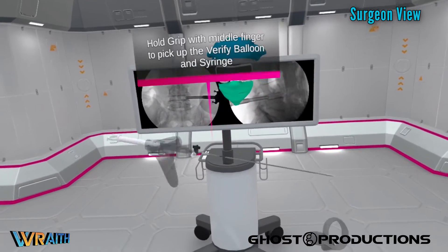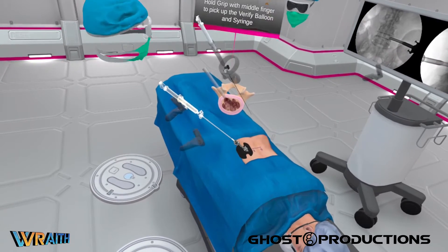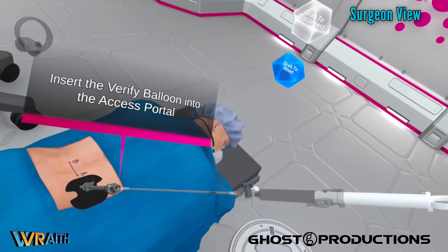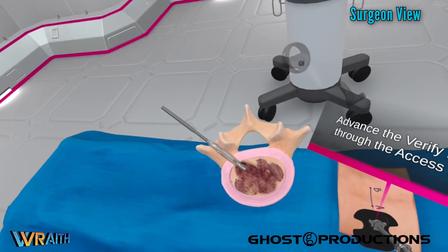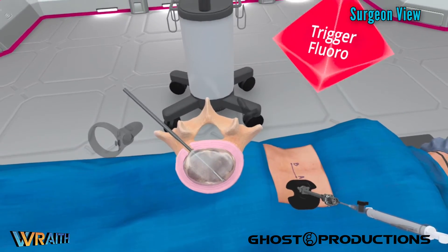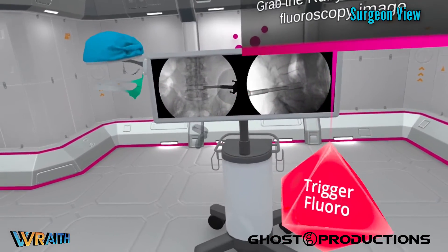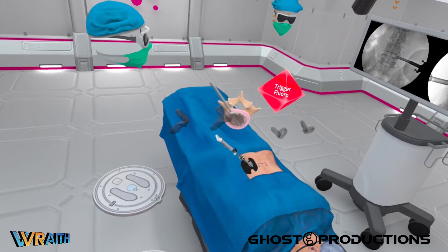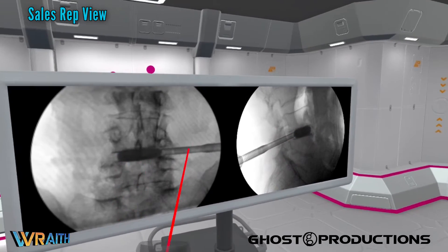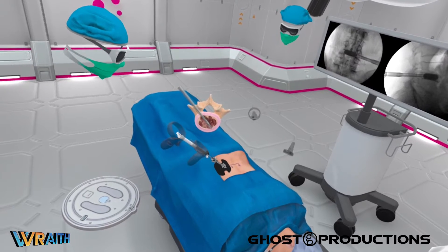This is what we're calling the verify syringe — it's a balloon catheter with an expandable balloon filled with contrast. We can advance that into the disc space and get confirmation with fluoroscopy for how well we've done with our discectomy. Since we can't see it floating next to us, we can use fluoro to take a look and get confirmation of what our discectomy looks like. Now this portion can get unplunged.